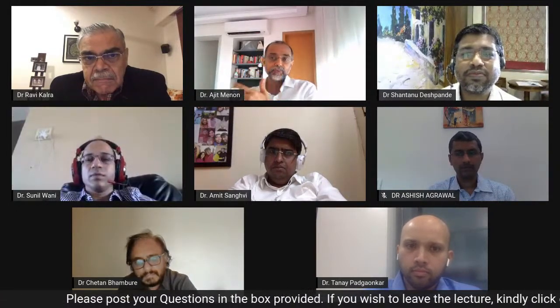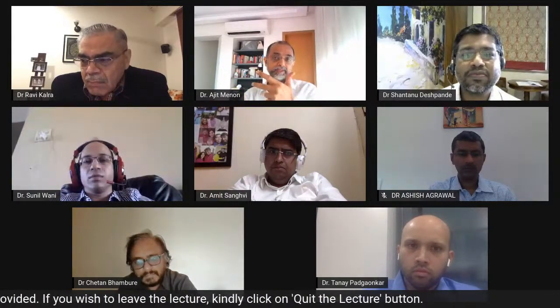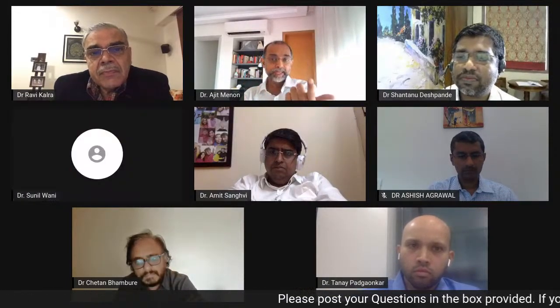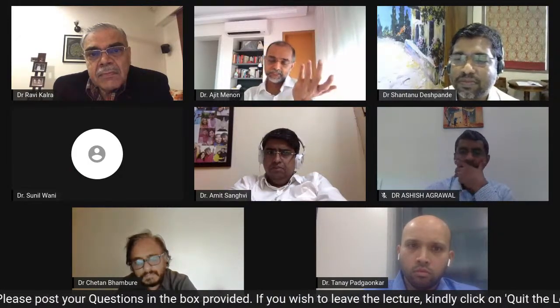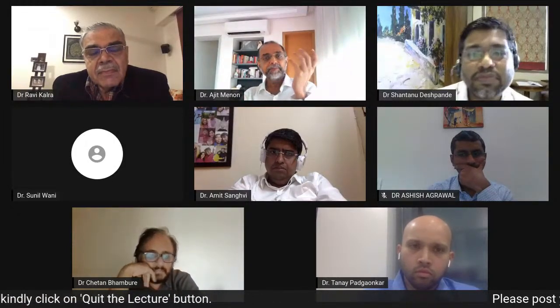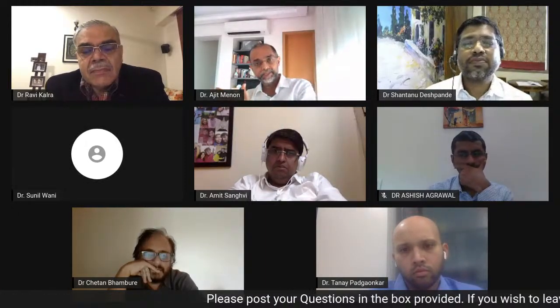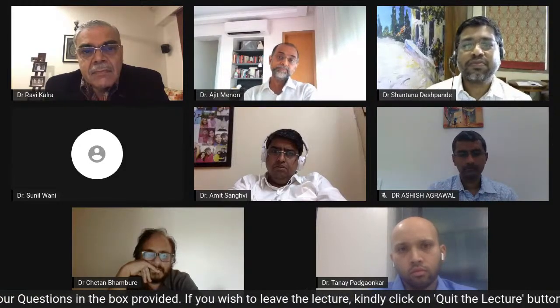Coming to what strategy, probably a DK crush would be a good idea in this case, because the angle is not very great for a TAP, as Dr. Kalra said. It has to be a DK crush or a mini crush technique. A mini crush technique is probably equally good, though results are better with the DK crush. And again, like I said, preparing the bed in the diagonal would be as important as preparing the bed in the LAD when you go in with a pre-planned two-stent strategy.